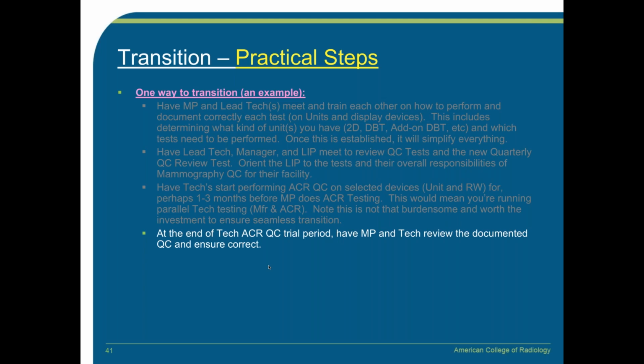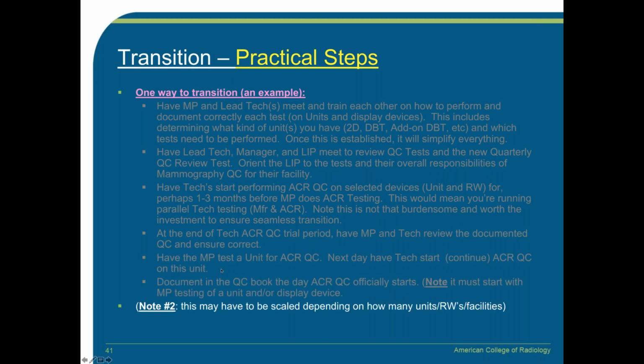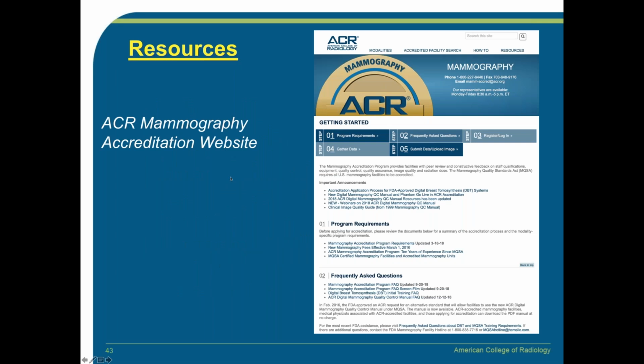There's no real impact of when the physicist does that, besides they can stop doing manufacturing QC. So it's that 1-2 step. And finally, where do you go for help?